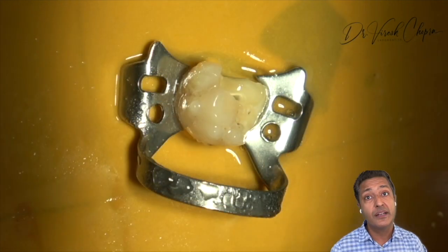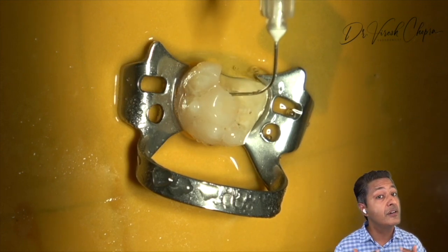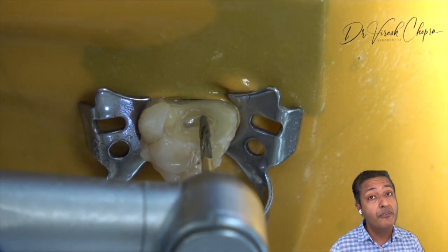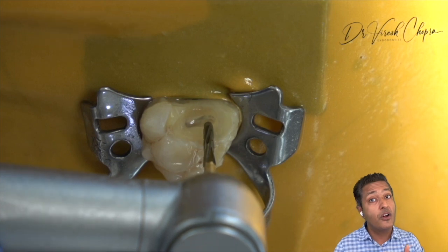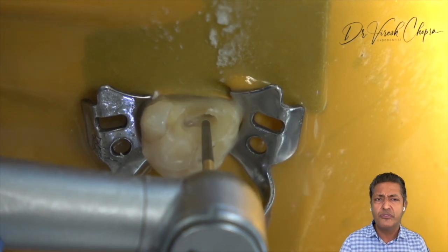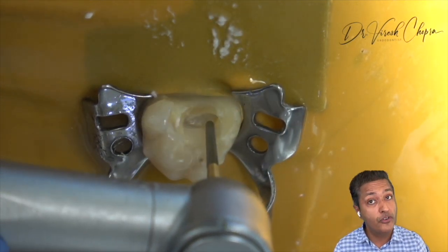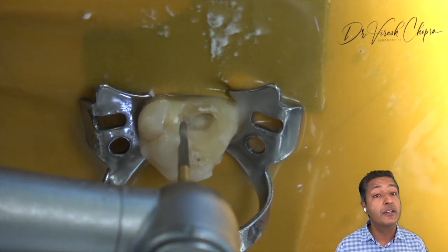Before putting any instrument, kindly please irrigate to remove the debris from that particular area and have clear visibility. Irrigation is one of the most important steps, but at the same time, one of the most ignored steps. Once the exposure is confirmed, this is the time when we change our burr to an Endo Z burr. It's a non-end cutting burr. Touch the burr till the point of resistance and then lift it 0.5 millimeter so that you don't touch the floor, and therefore by doing this we are avoiding any pulpal floor perforations or touching the pulpal floor. Now we need to de-roof the pulp chamber completely.